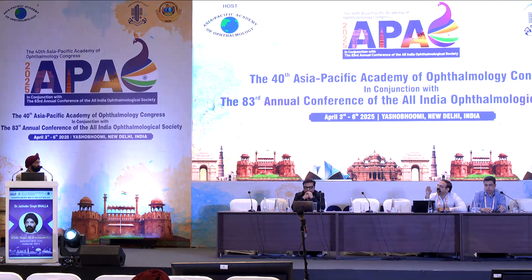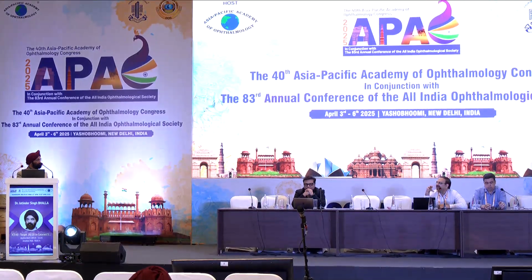a bang on calculation. And secondly, the ray trace formulas like the Olsen and the Okulix also give you a very good overview. And in fact, in these eyes, I would say that no single formula would fit the best. So actually, we must take an average of multiple formulas, and as we optimize our A constant over a period of time, we see which particular IOL power fits in most of these, and which formula goes the best. So you take an average of most of these, and then you are almost at your 90% accuracy. Exactly.